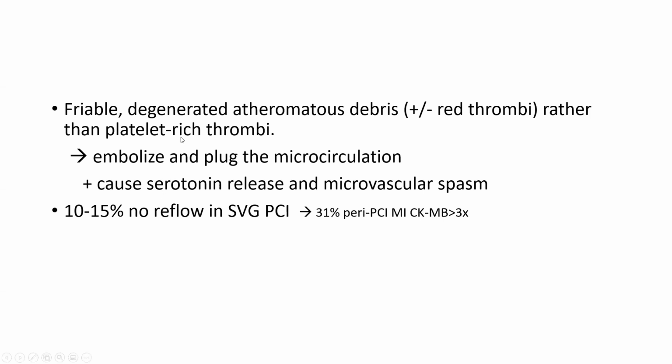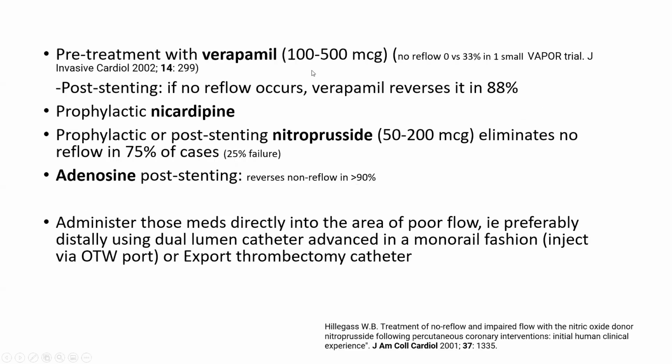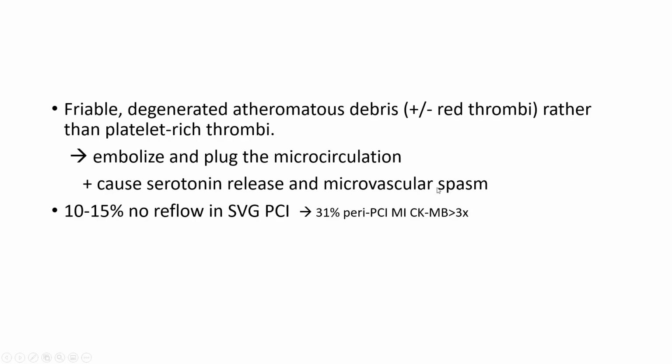And that heavy amount of atheroma embolizes and plugs the microcirculation. It also causes serotonin release and microvascular spasm, hence the reason those vasodilators work. They relieve the spasm and they also increase the size of the microcirculation so that it can eliminate the microdebris. There is a 10 to 15% risk of no reflow in vein graft PCI.